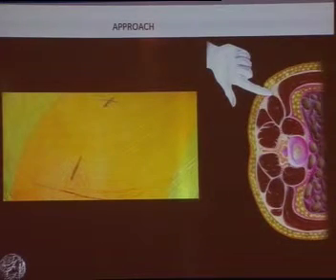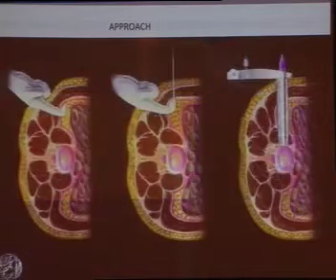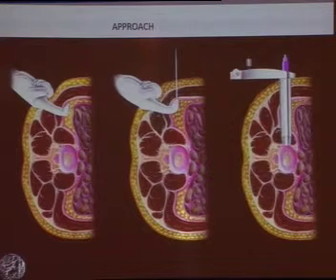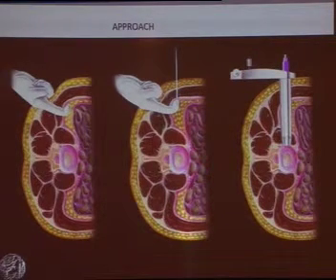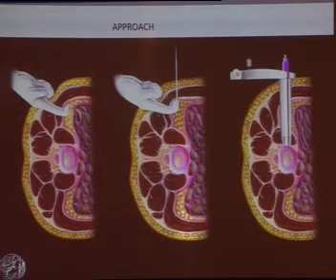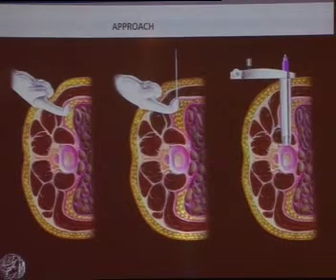First, I describe the use of the accessory posterior portal at the border between the erector muscles and the abdominal obliques, and the insertion of the surgeon's finger anteriorly through the muscle layers in order to identify the retroperitoneal space and guide the dilator from the direct lateral position to the psoas muscle. Personally, I prefer the dissection of the internal and external obliques under direct visualization. So after the incision of the transversalis fascia, the presence of the retroperitoneal fat and the psoas muscle confirm the retroperitoneal access.